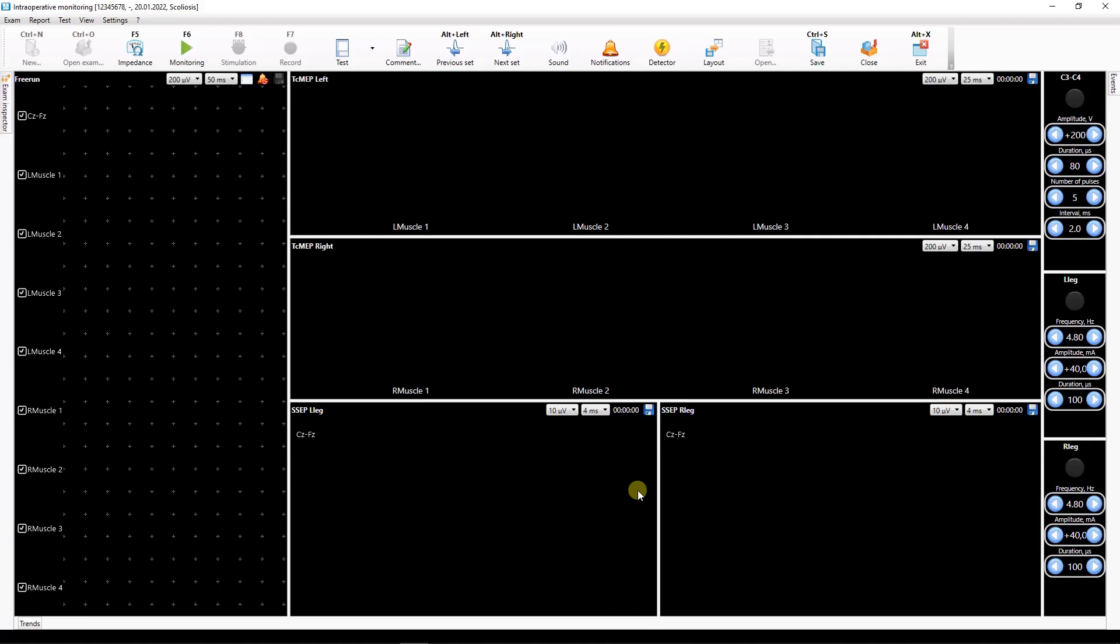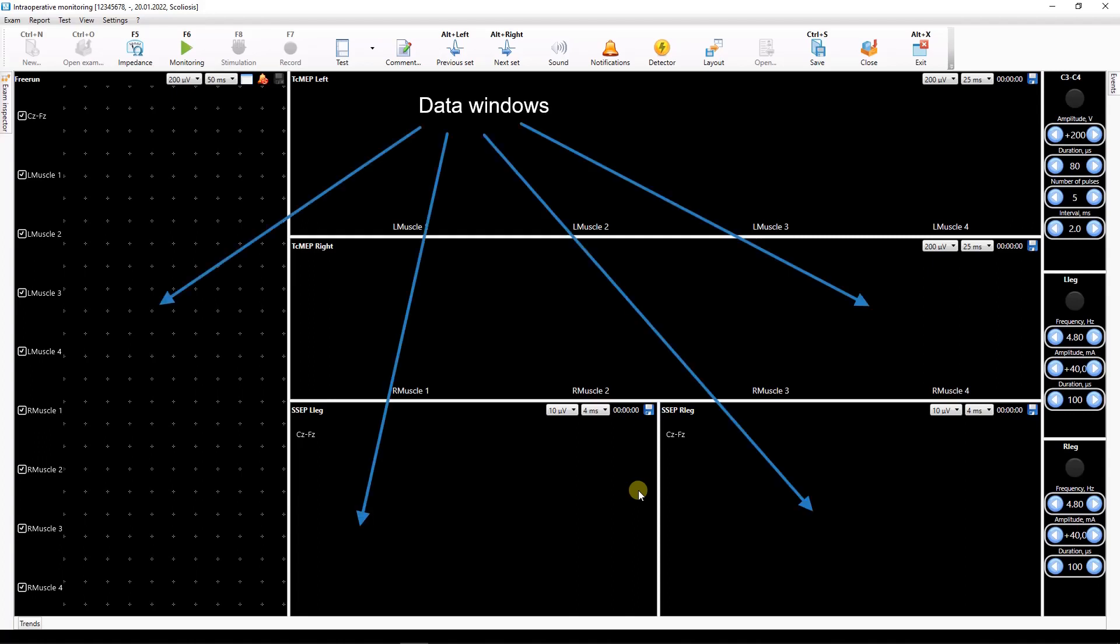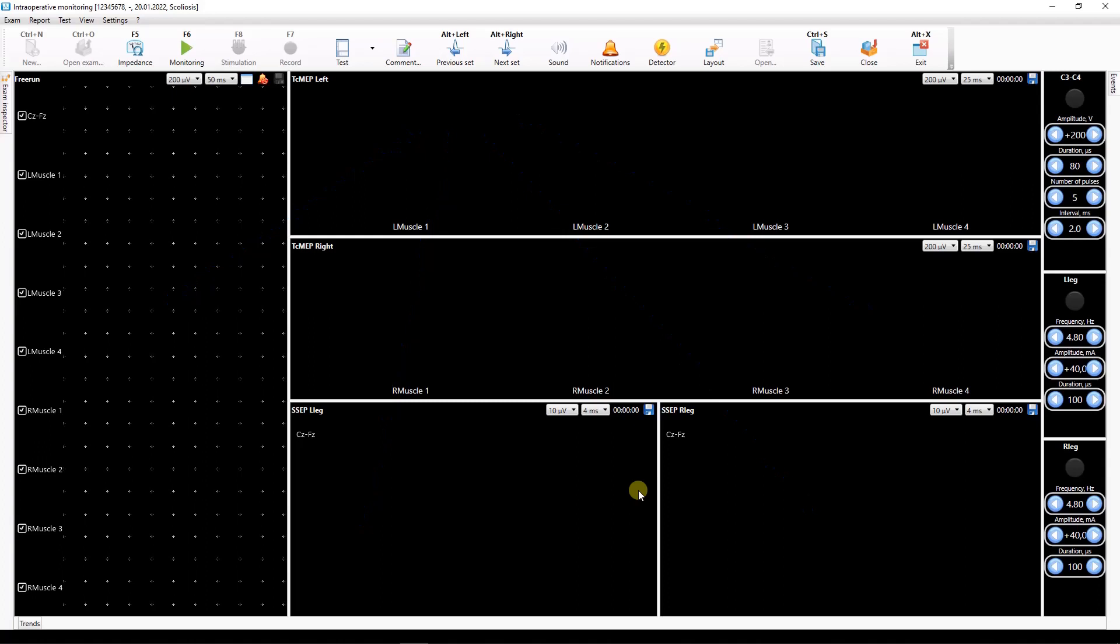The test window appears on the screen. The test window contains data windows according to the selected template and stimulator controls.